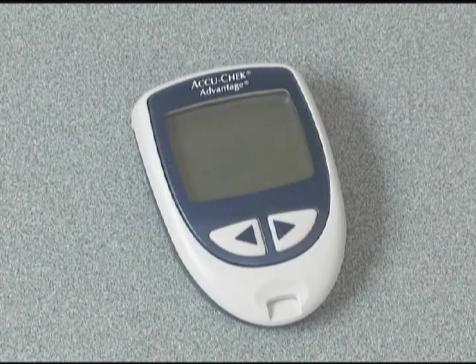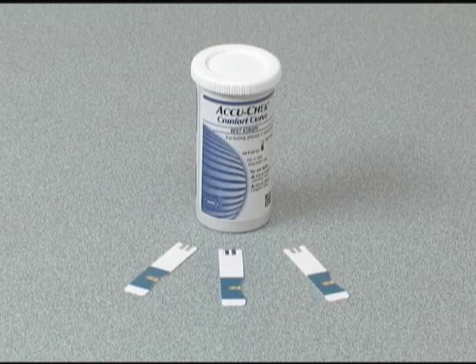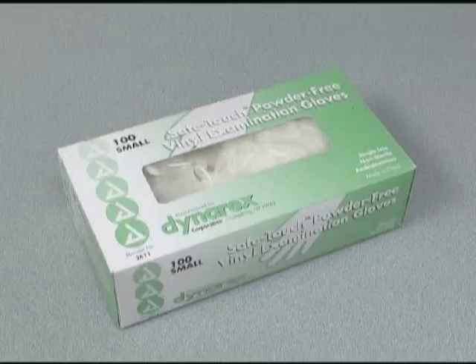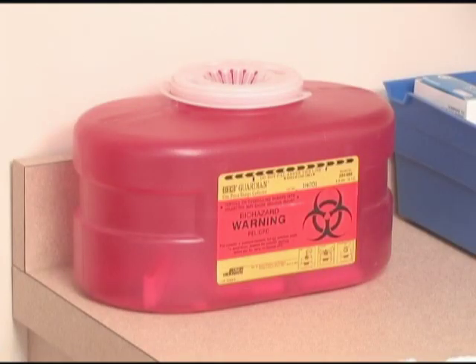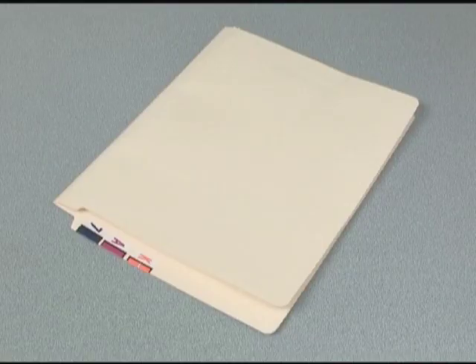Materials you'll need to check blood glucose levels with this meter are the AccuCheck glucometer, AccuCheck test strips, puncture device, sterile 2x2 gauze, disposable gloves, a sharps container, a biohazardous waste container, and the patient's chart.